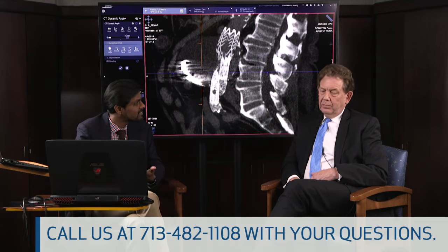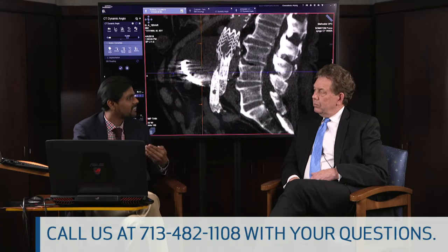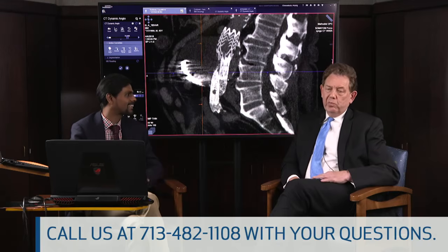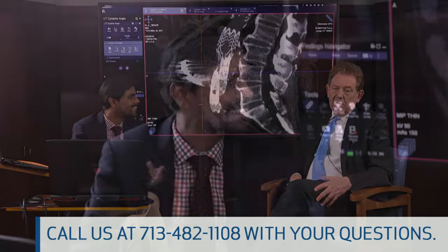So that's another reason to study these patients upfront correctly before we put in coils. Some approaches are to put in some coils and hope that nature will take over and promote the embolization. If the coils are in the wrong location, we haven't really done anything good for these patients.